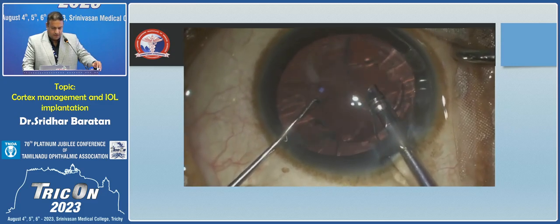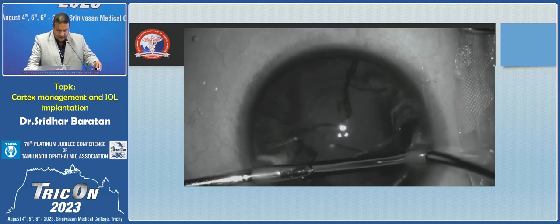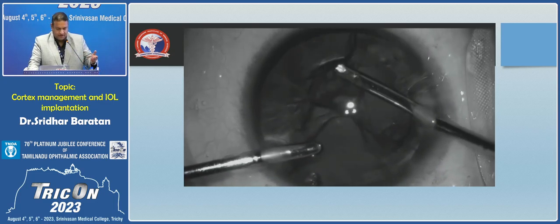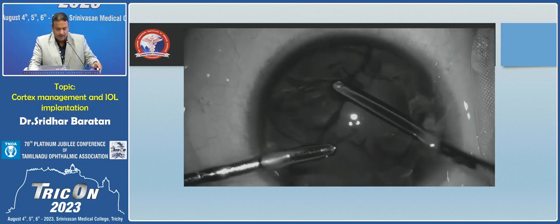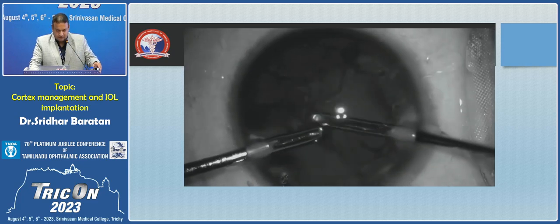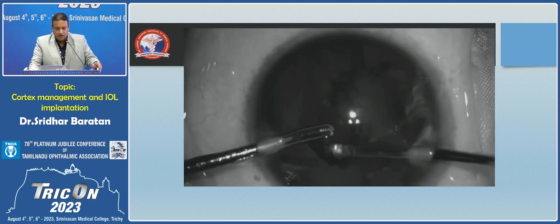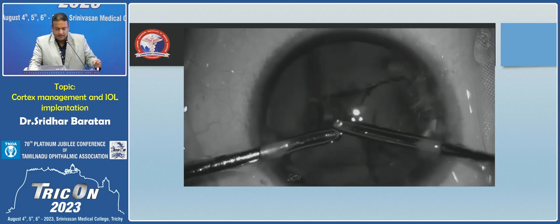So this is the end of the surgery. If you see, this is a very interesting technique where you actually hydrate the lower part of the cortex, which causes the cortex to come out pretty easily. And there's a nice demonstration here of carpet bagging, where you can go and pull two ends of the cortex and simultaneously bring it out.